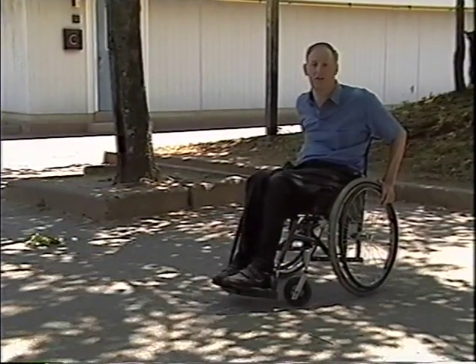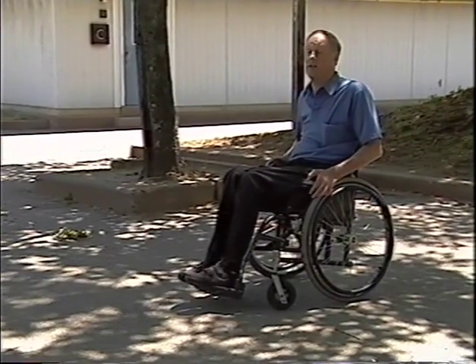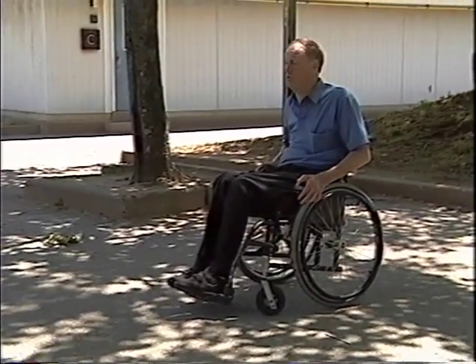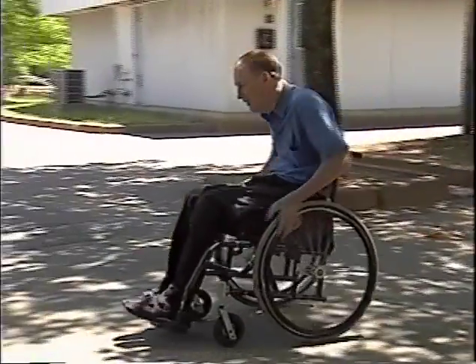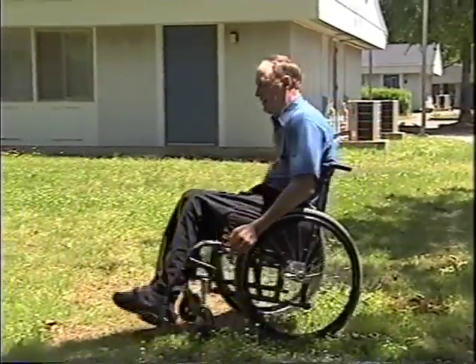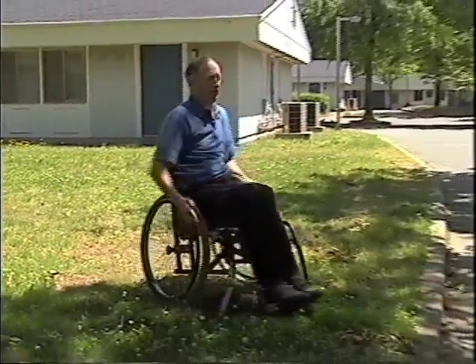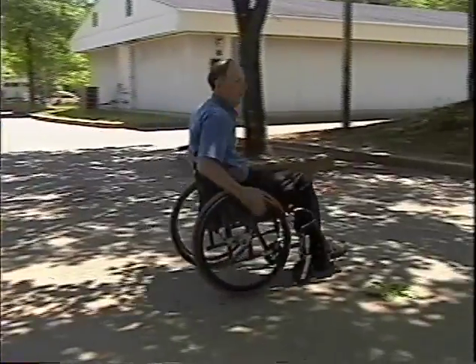It's one thing to jump over the little wooden curb we demonstrated on — it's quite another thing out in the real world where the curb won't move. But it's not a big deal at all. Just pick your shot, do things right, and you should be all set. Keep your weight back on the softer surfaces. Coming up to it, keep yourself rolling. Not a problem.